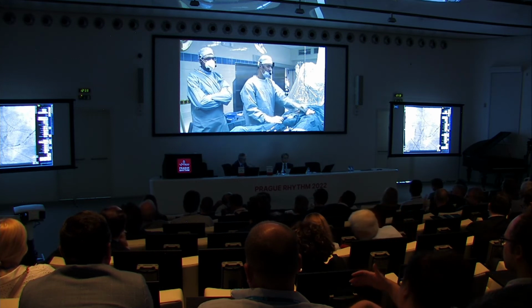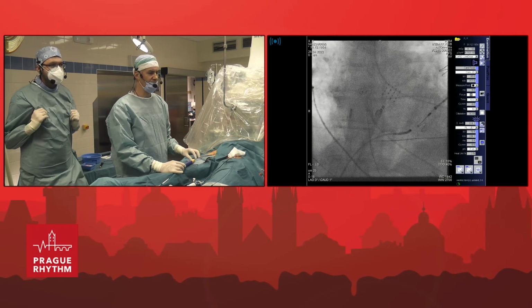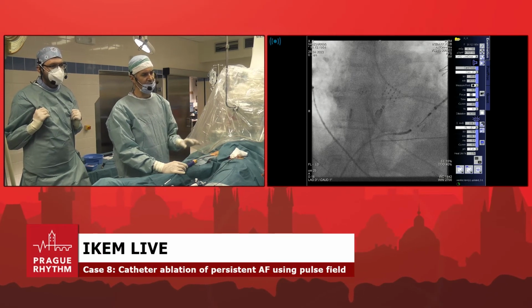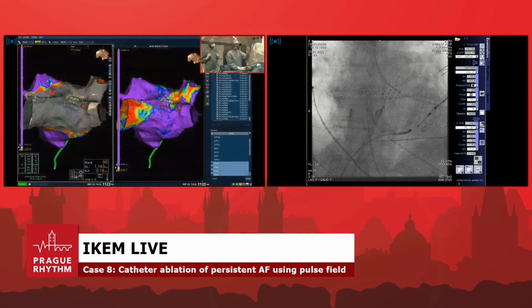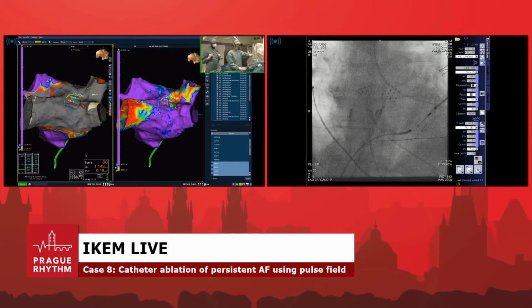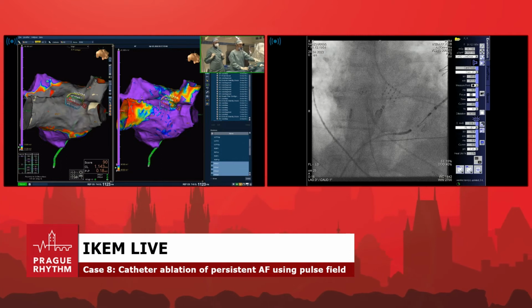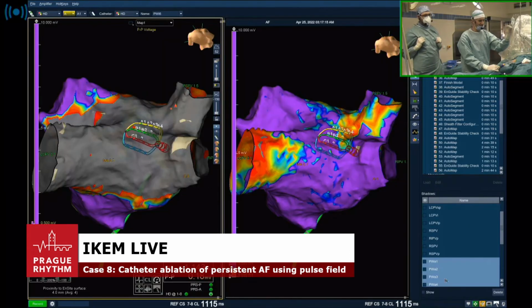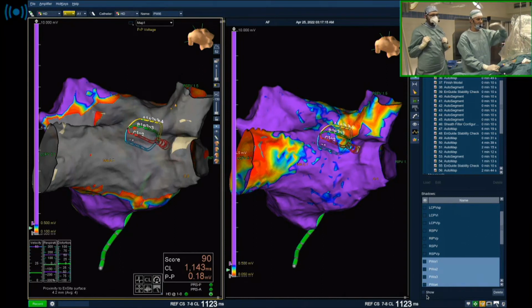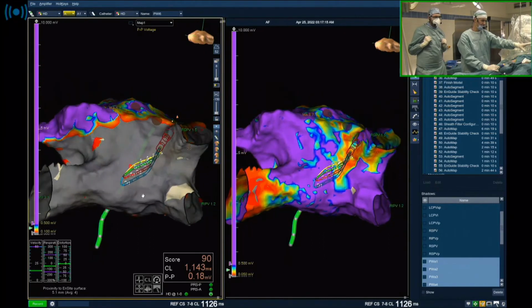Hello, everyone. So you left us when we were doing the right superior PV lesion set. So we did right superior, and we did the posterior wall ablation in 2 rows. Jan, could you show us the map we did after. So you see that we have the left common trunk and the right-sided veins electrically silent, and the posterior wall electrically silent. So we have completed the posterior box lesion. You see the map before, you see the map after.